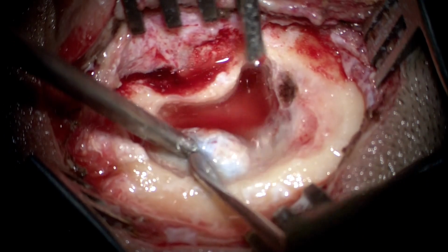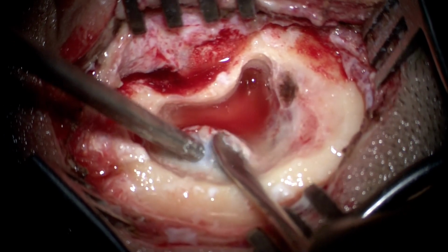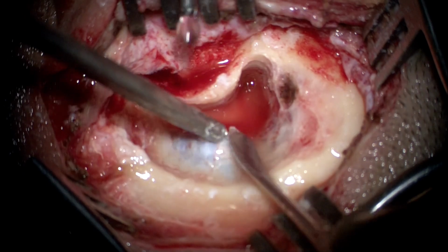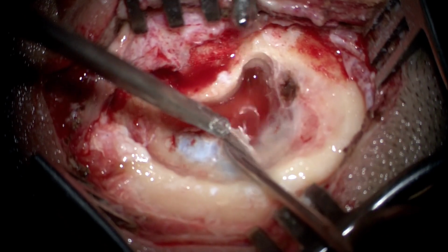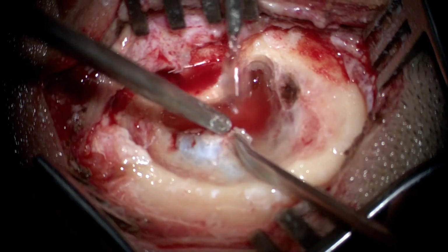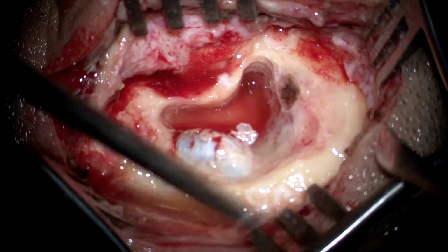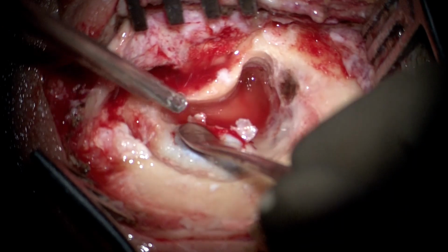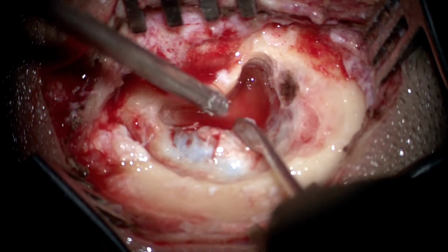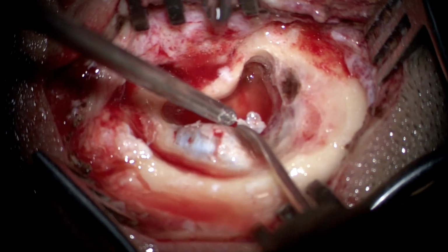One has to make sure that you don't leave islands of bone behind, because once you start decompressing this sinus, if you press on those islands of bone, they themselves can cause puncture of the sigmoid sinus dura. So, like I said, we are not using the Bill's Island technique. We would be unroofing the entire sigmoid sinus dura for us to be able to then push it back and decompress it. We'll see in a short while how that's done.